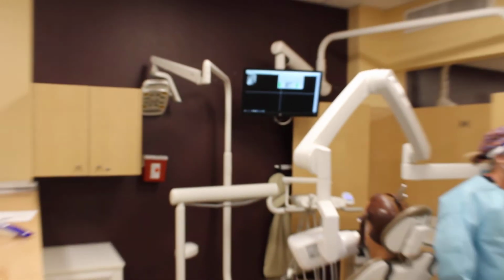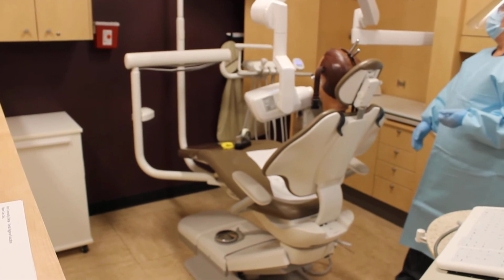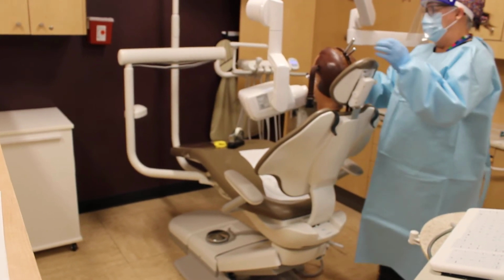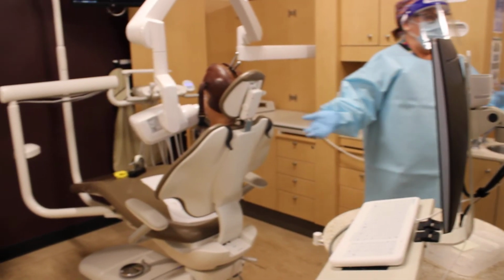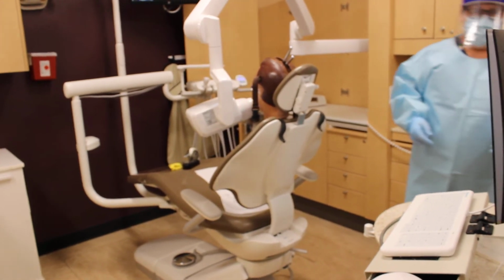I didn't get enough forward to get the distal of the canine like we like in a premolar, but you can't always get it. But I got everything I needed, other than the distal that came out. Okay. So it is possible to do it with the landmarks. But I have another system that you might like, and that's when we use that sheet that I just made up for you.